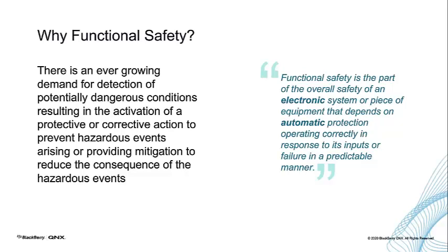Or are there pieces that maybe the communication lines have gone down? We can go to a safe state. And then there's some other things that we might be able to do in order to recover. But that's the ability for the system to essentially either repair itself or be able to act accordingly in a safe mode, not just proceed along with its functionality.